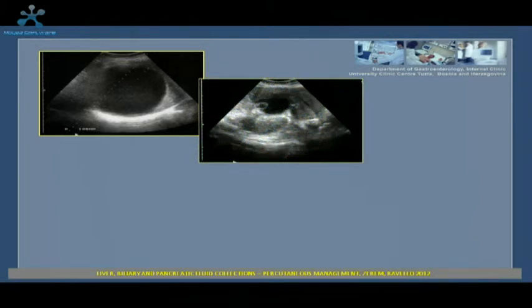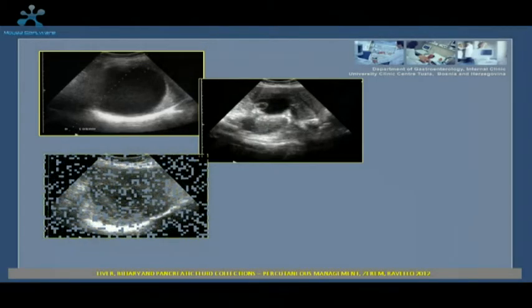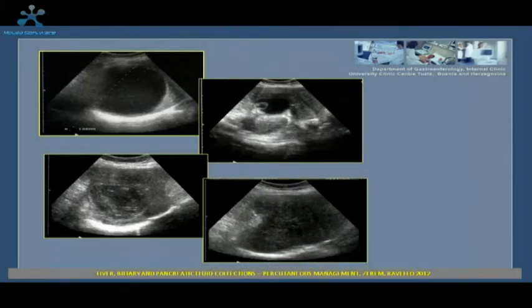confirmed that the echinococcal cyst was alive. This is scarring in the place of the echinococcal cyst after its resolution by the PAIR technique, and this is the control examination of the same liver without the echinococcal cyst after its resolution by the PAIR technique, with a large defect in the liver tissue and numerous new adhesions in the right upper quadrant of the abdomen after 4 surgeries.